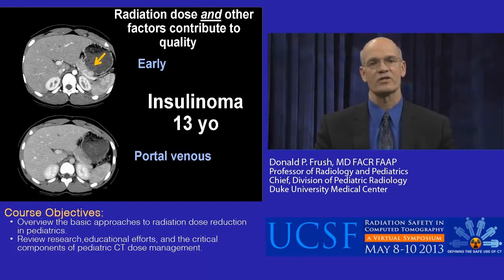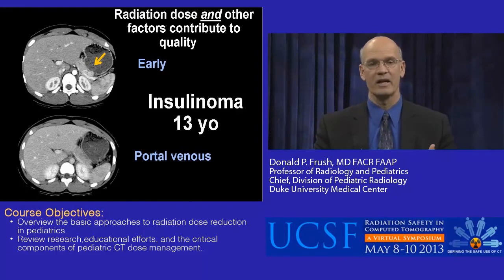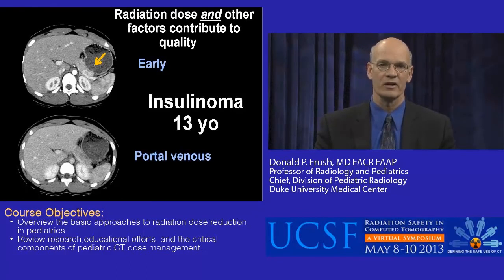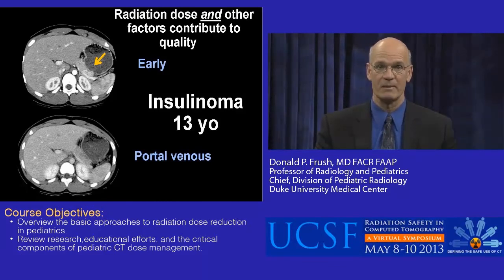Remember, contrast administration is important. We're talking about the quality aspect here, and in some situations you may need to do dual phase and pay attention very carefully to what you're looking for and when optimal enhancement will happen. Early enhancement on this insulinoma in the pancreas identified this lesion. If we had simply done a portal venous examination, it would not have been evident or obvious by any means.